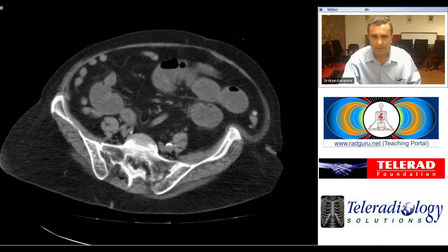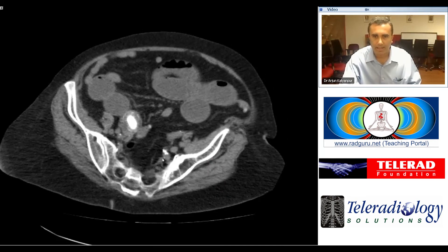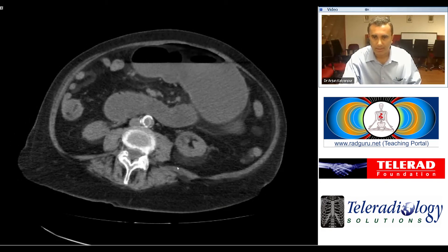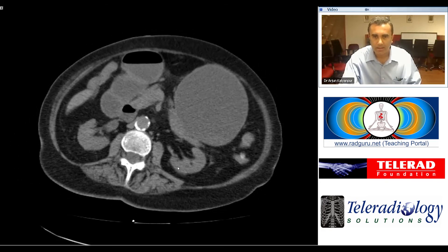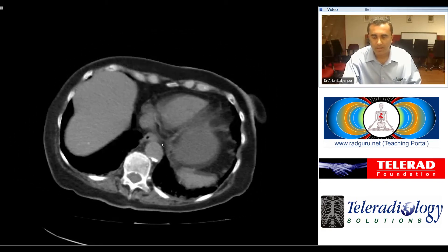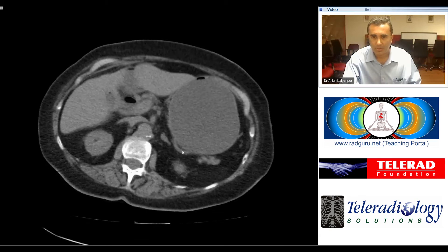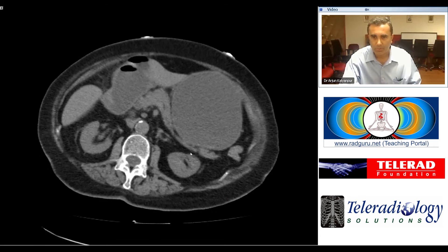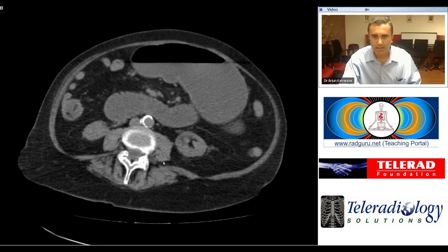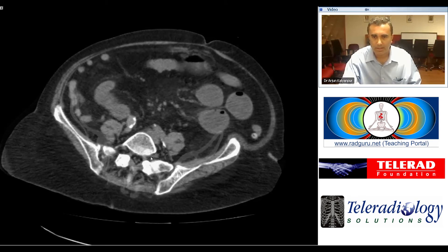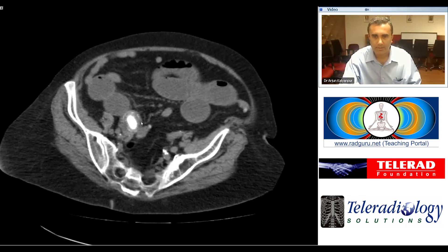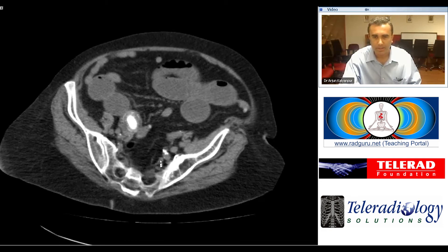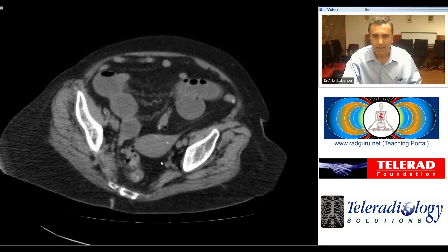The bowel distal to that calculus is collapsed, as we can see here in the right flank. This is a nice example of gallstone ileus, where the classic triad of findings includes air in the biliary tree, small bowel obstruction, and a large obstructing calculus in its typical location in the distal ileum.